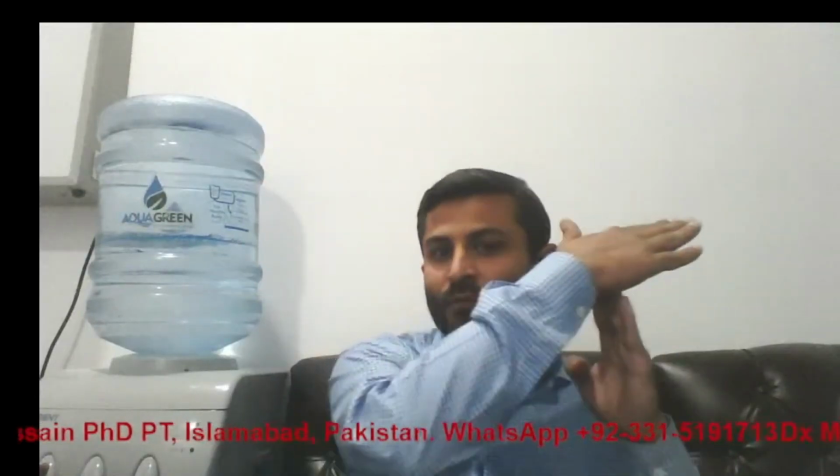So I will briefly let you understand what the appearance of bone is. The bones actually do not let the ultrasound beam pass through them. Because of this, we cannot see the whole bone. We can see only the periosteum of the bone, and this periosteum appears hyperechoic. What is the difference between a bone and a tendon? A tendon will allow the ultrasound waves to pass through it, whereas the bone will not.